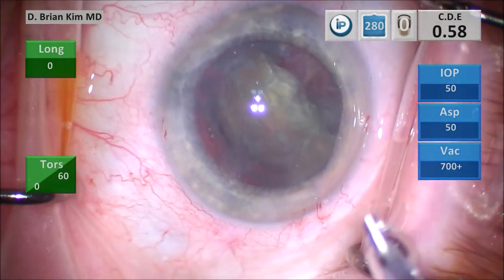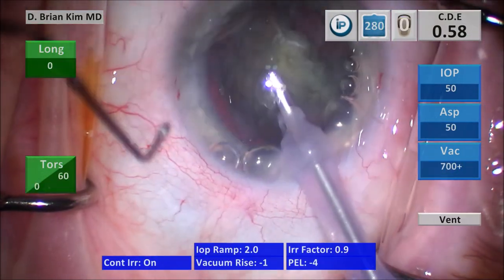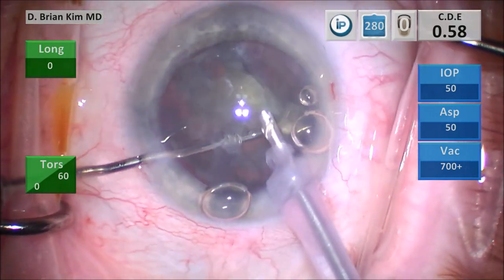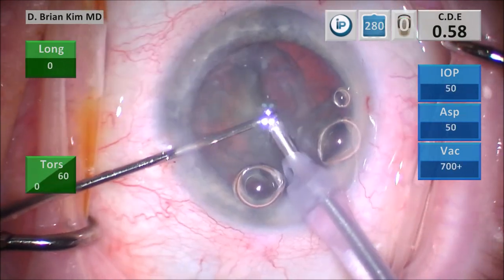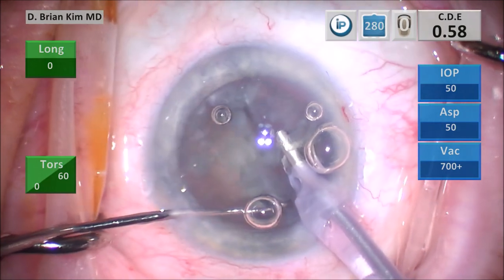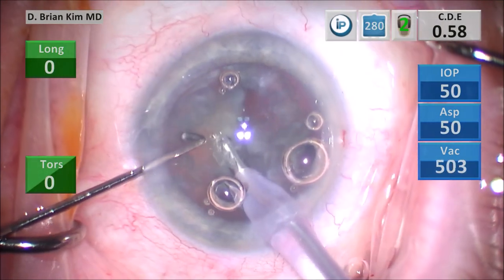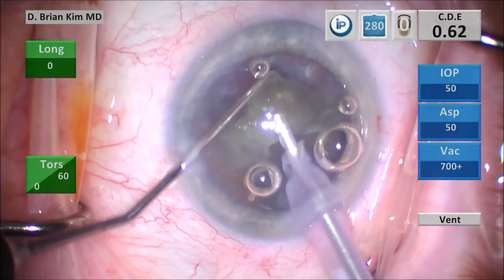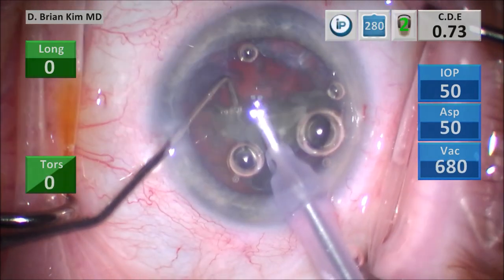I'm going to lift the incision again with the chopper, go in with the phaco tip, and now you can see the lens is quite mobilized. I'm trying to turn it, but it's not really turning still. Rather than turn the lens against the zonules, I just grabbed the lens with high vacuum, pulled it up, and then I was able to chop the lens in half. I'm using mechanical fracturing forces, using high vacuum and some ultrasonic energy to remove the lens pieces.